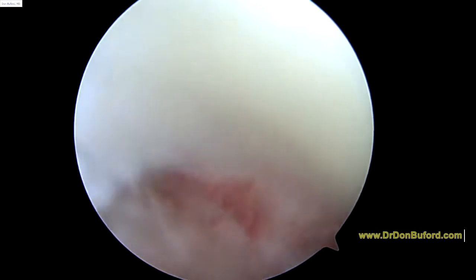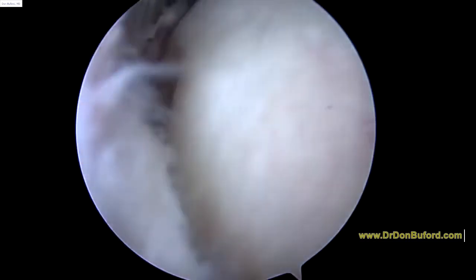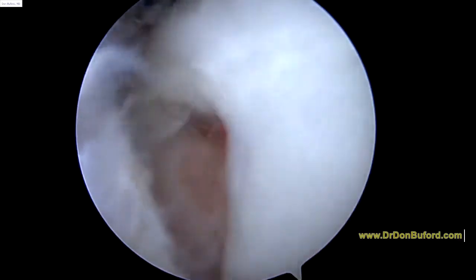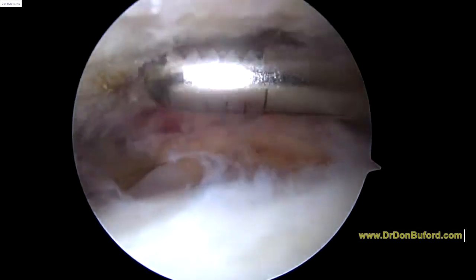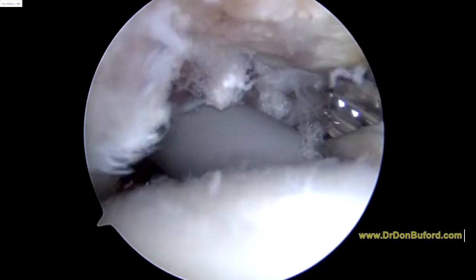Invariably, the damage to the tendon is going to be a little bit bigger than that hole that we see. But at least now we know that we're in the right place. See, as I rotate your arm, that's the area in the tendon. And we'll show you how we fix that in a minute. Luckily, the rest of the tendon looks great. This part of the tendon looks very healthy. We're going to go ahead and take off a little bit more bone in a minute. So we're just finishing out our decompression.